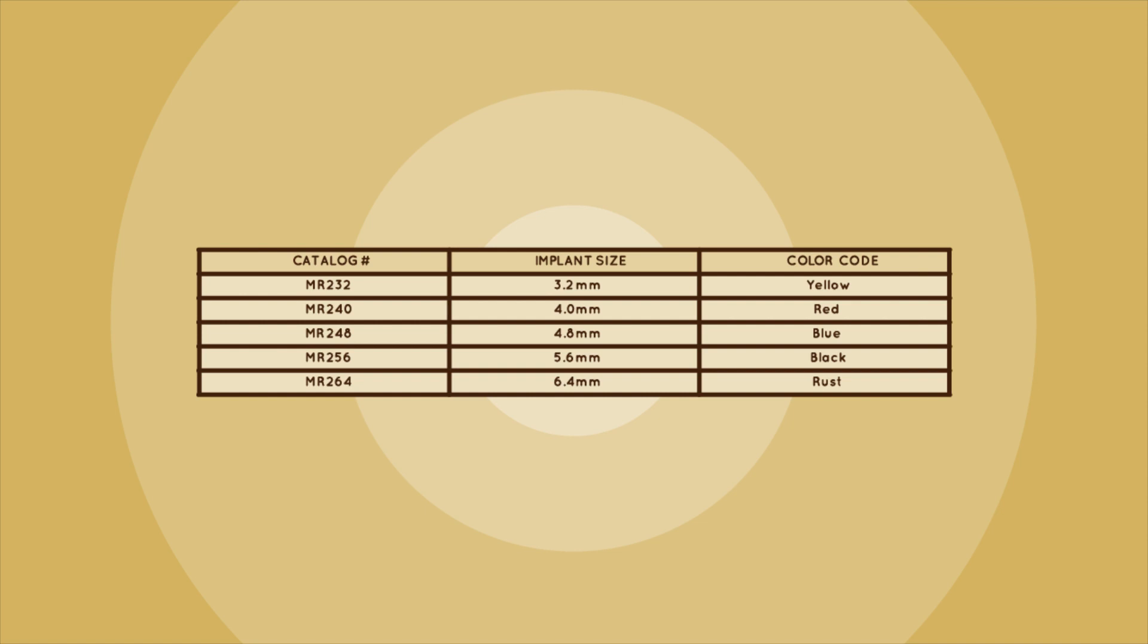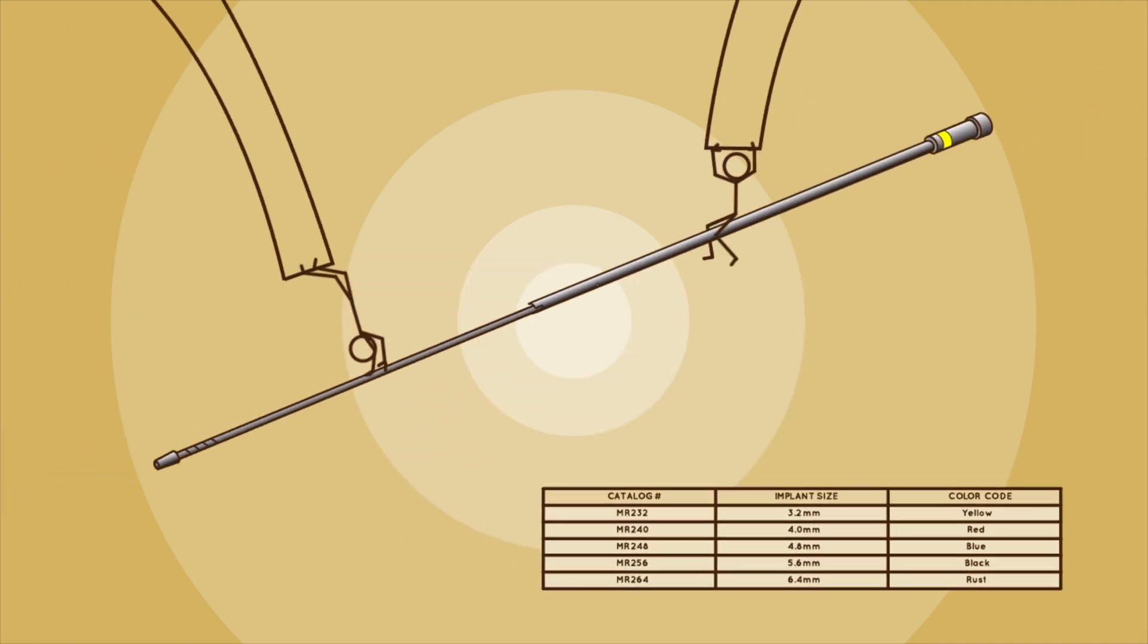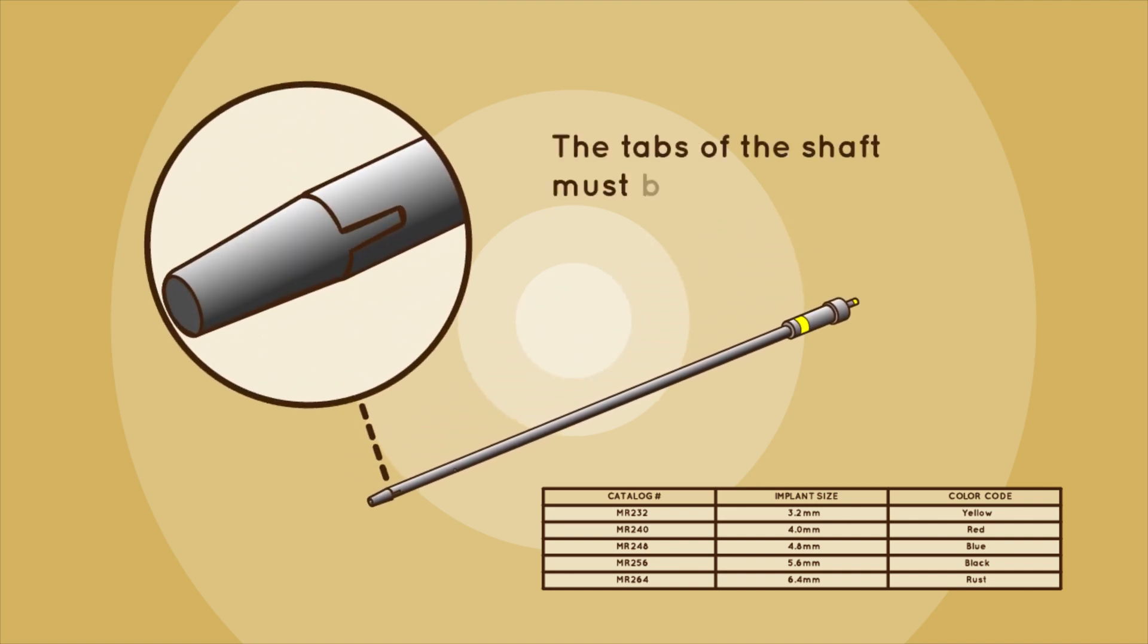Select the required size for use before starting the assembly process. Once the required size of shaft and tube is selected, insert the shaft into the tube as shown. The tabs of the shaft must be fully engaged inside the notches of the tube.